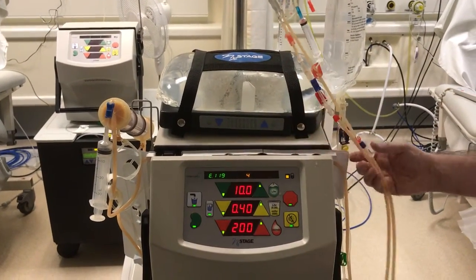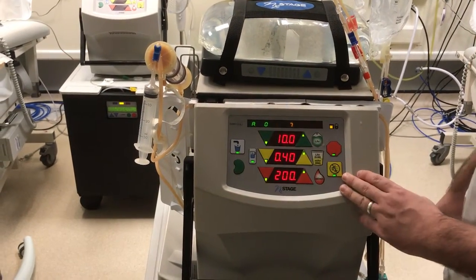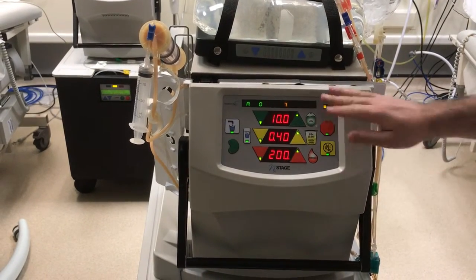Open your clamps and press green to go. Your dialysis will now begin. Let the machine do a full circuit first so it puts all the saline around the circuit.